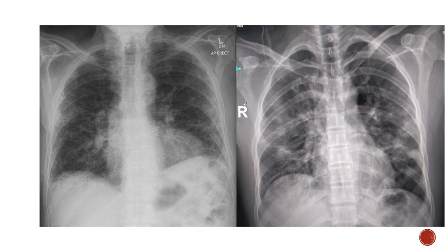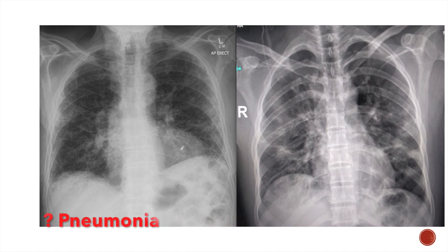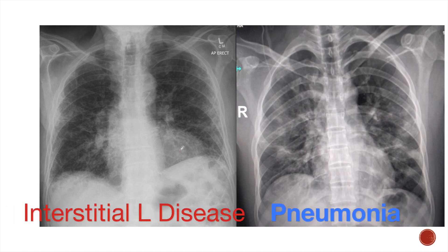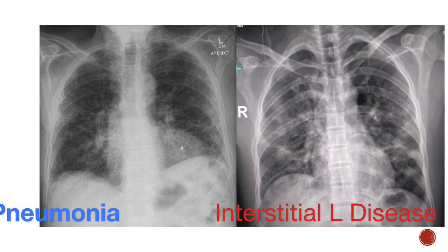Look at these two X-rays. Both these patients presented with dyspnea and cough for variable duration. Can you differentiate which one of these patients has a diagnosis of interstitial lung disease and which one has pneumonia? Pause this video for a few seconds and look at the X-rays. If you can't differentiate interstitial lung disease from pneumonia with confidence, then this video is for you.